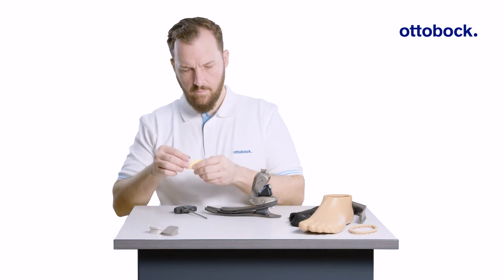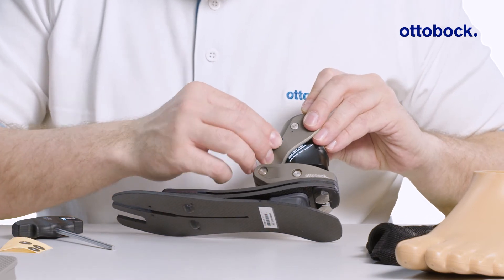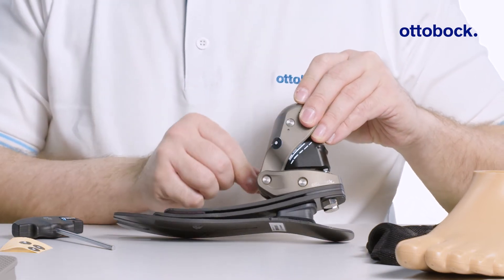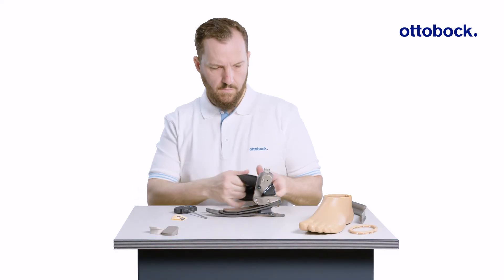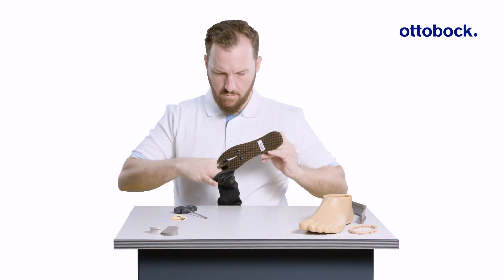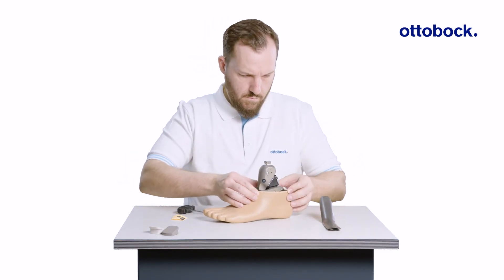Next, place a colored sticker on the subtle alignment marking on the ankle for better visualization during the alignment process. Finally, put on the spectra sock and don the footshell. Now the Taleo ADAPT is ready to be bench aligned.